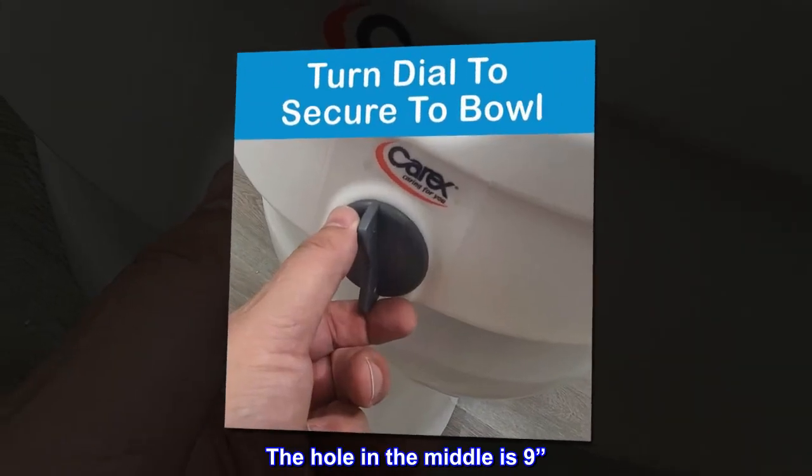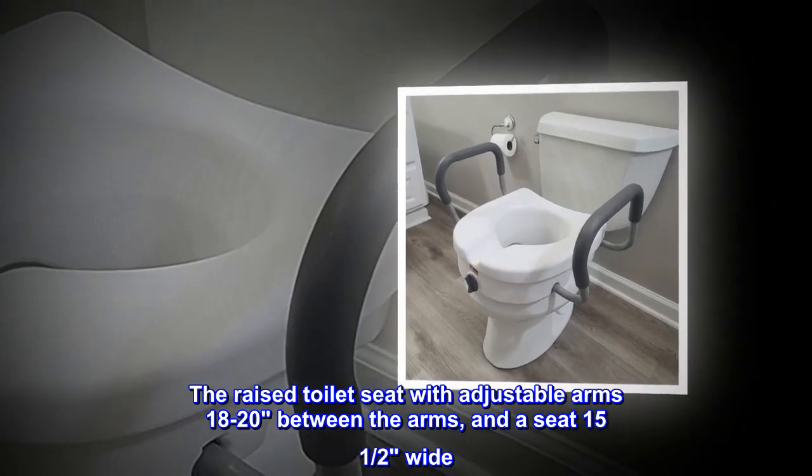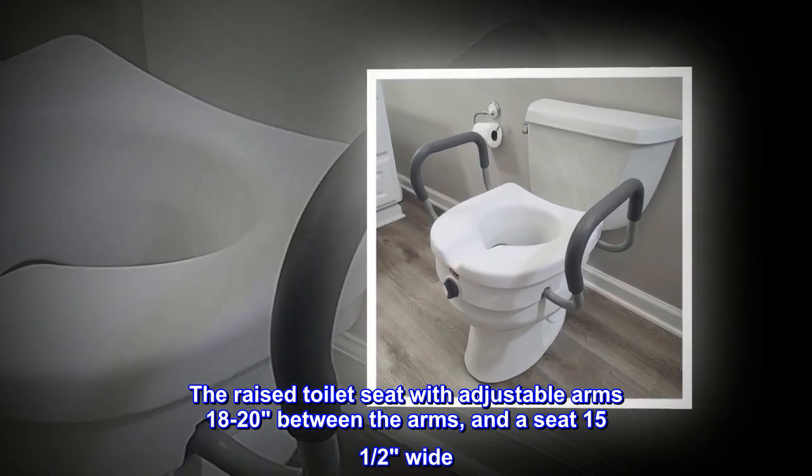The hole in the middle is nine inches. The raised toilet seat with adjustable arms is 18 to 20 inches between the arms, and a seat 15 and a half inches wide.